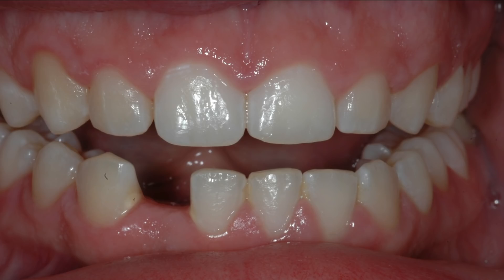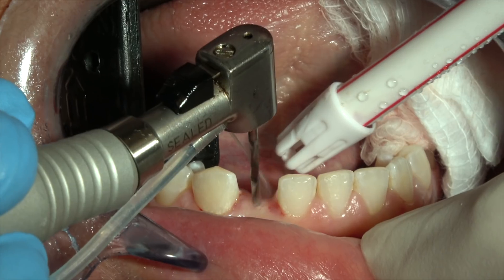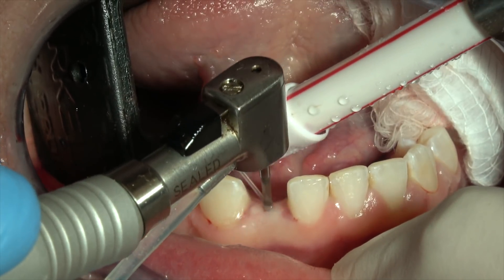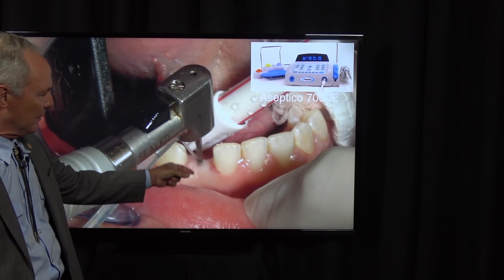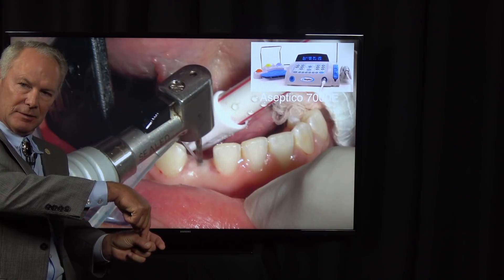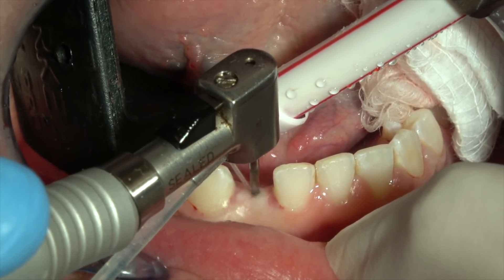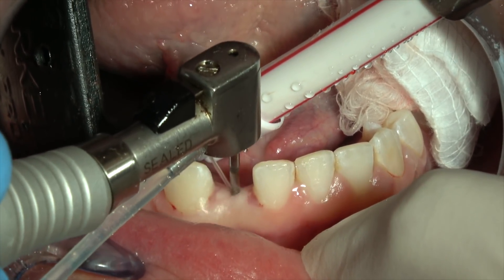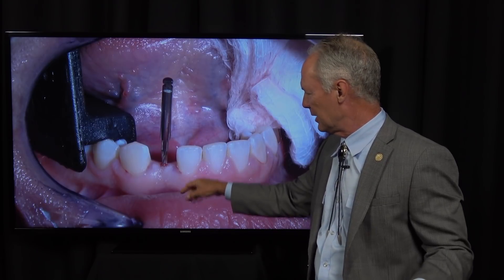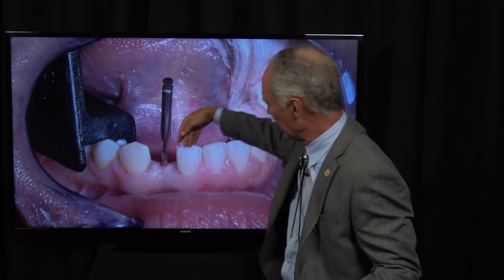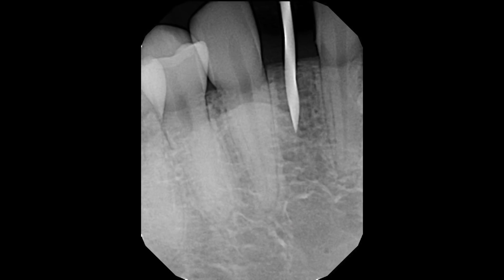This is the pre-op. This is the lower right. I'm applying chlorhexidine, wiping the tissue, and using the pilot drill. You can place your finger — if you're right-handed — like this to mark the buccal and lingual alveolar ridges, to keep the pilot drill in correct alignment because you don't want to drill through the lingual plate. With a small diameter implant you don't have to drill completely to depth, but I want to be sure I go into the bone enough. I'm ensuring the pilot drill is in alignment with the adjacent teeth and centered in the arch. Then I take a radiograph right now, only partway in, to confirm the drill is not angled off course — right between those two teeth.